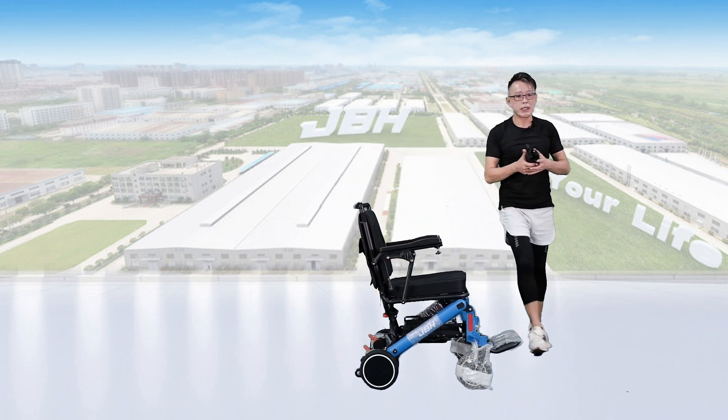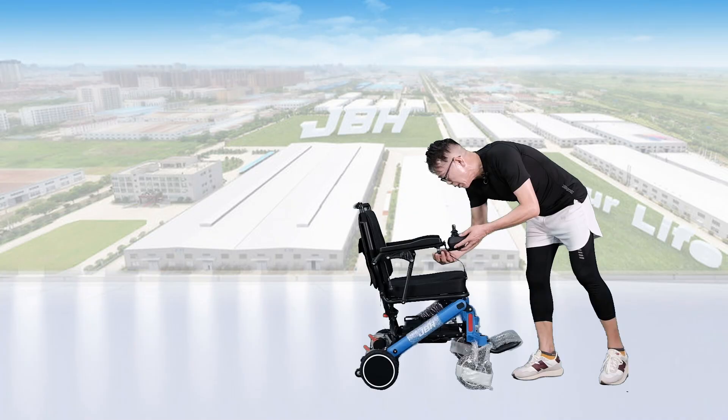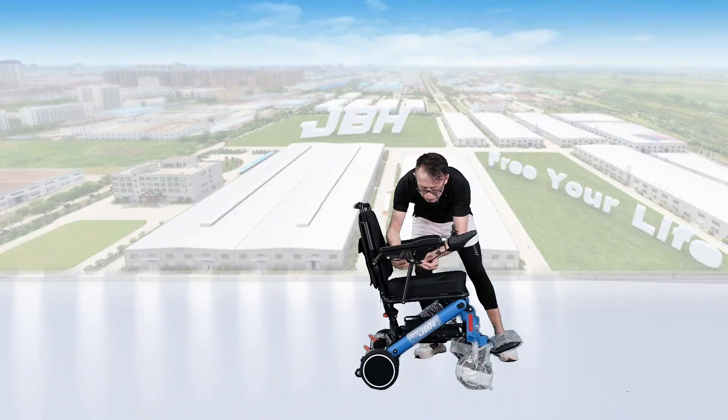One thing is the controller. There's a pipe here — we just insert it into the pipe of the armrest. Turn the knob to tighten, and then connect both connectors with arrow to arrow. Then turn the knob in the middle to tighten.